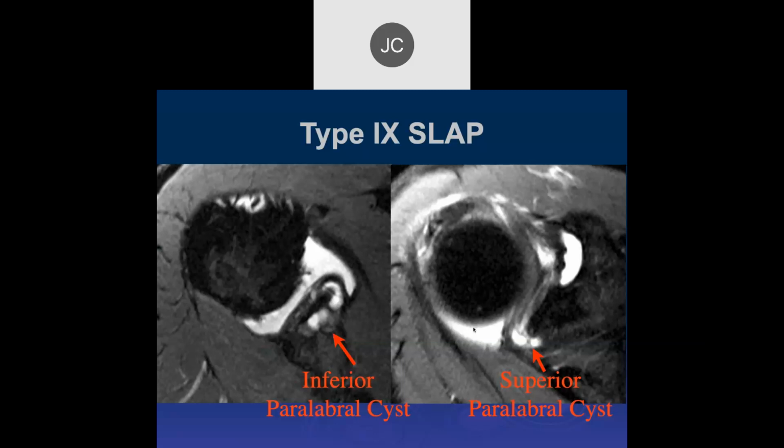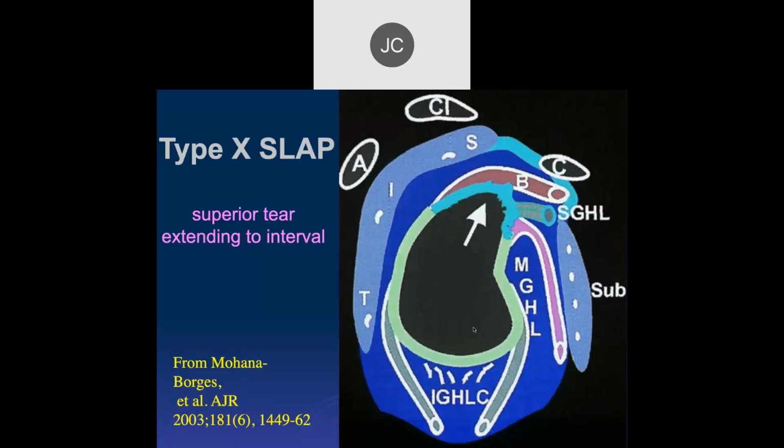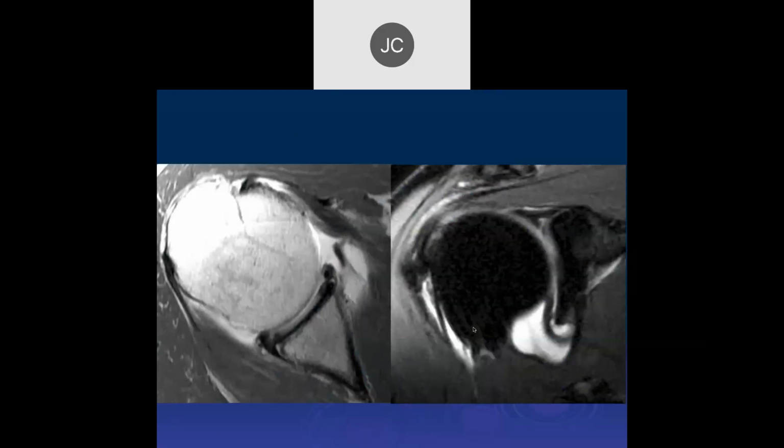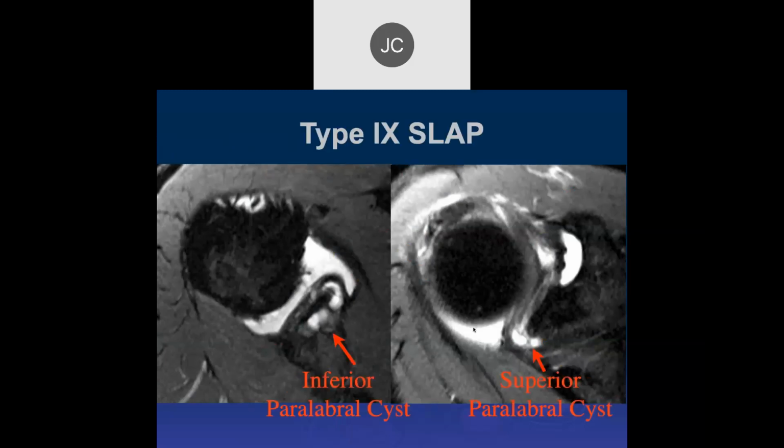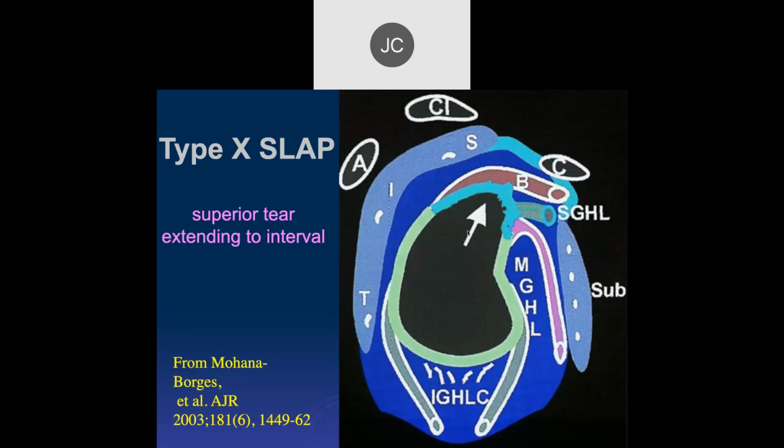They're typically seen in people with degenerative joint disease. I like to think of SLAP tears, and I think Snyder's original description, were really in athletes, which were acute traumatic injuries, not chronic degenerative tears. I think most of these circumferential tears are really in association with significant degenerative disease of the glenohumeral joint space, and those patients are usually more in line for joint replacements rather than arthroscopic repair, depending on age. Actually, I think this was described by, well, anyway, never mind.